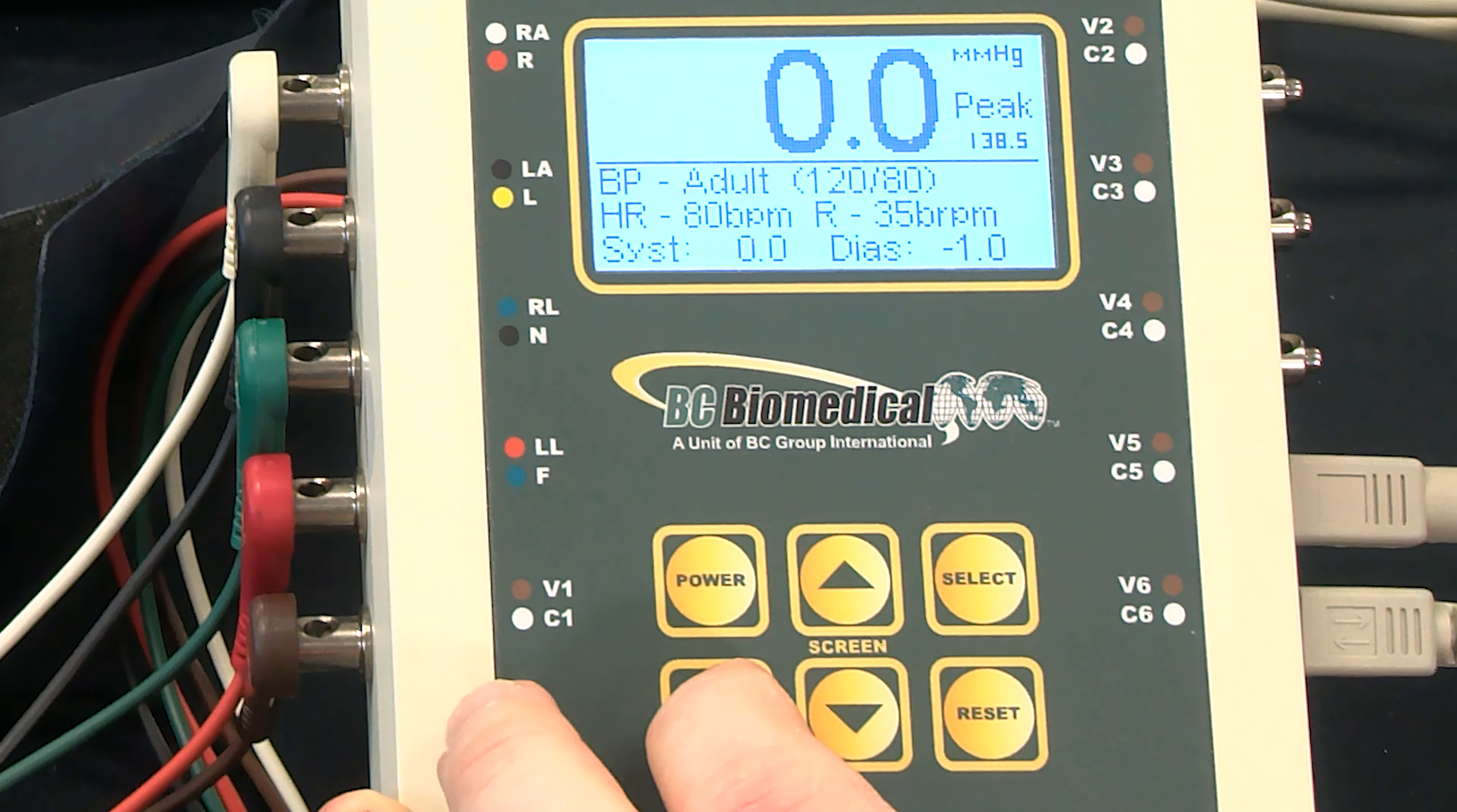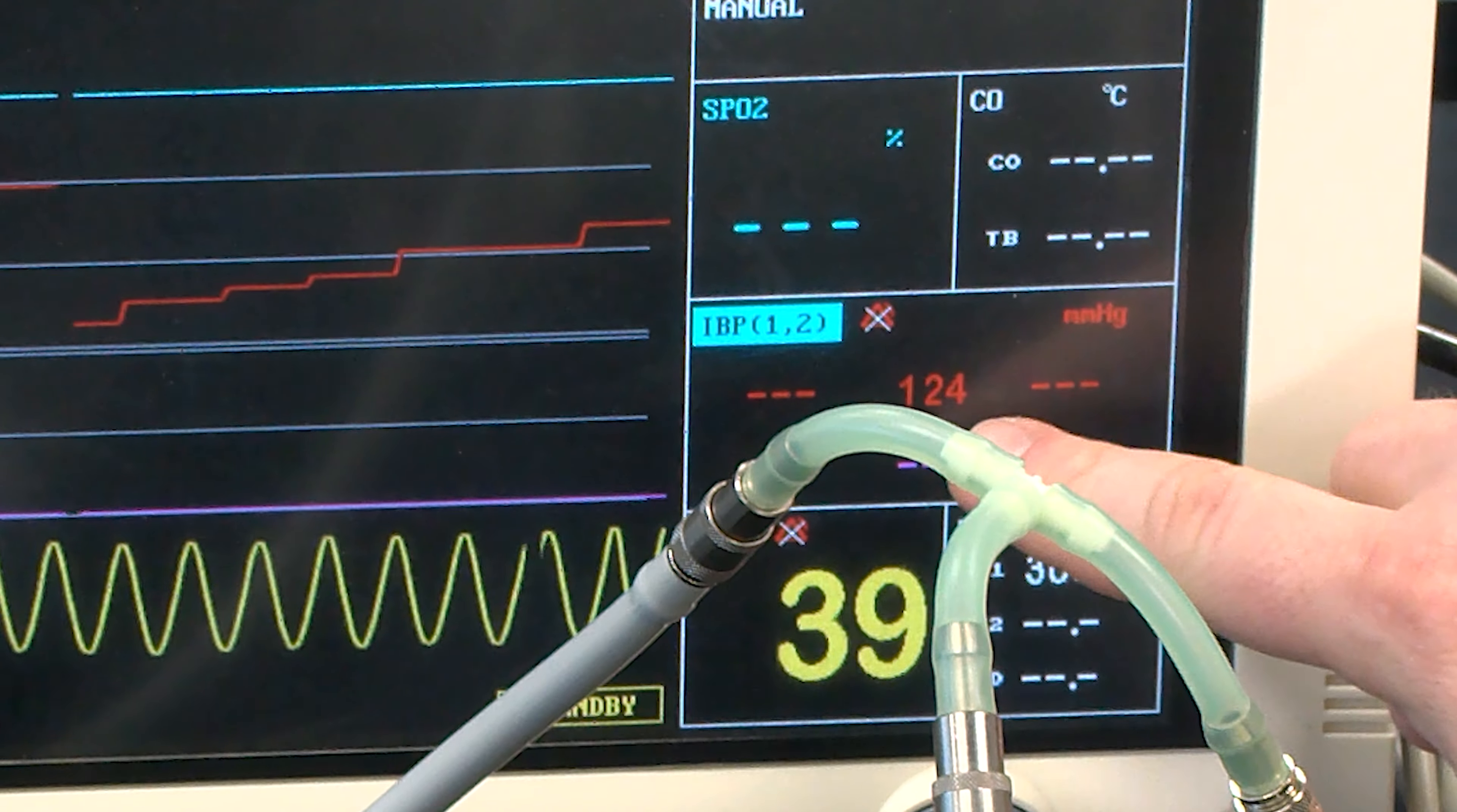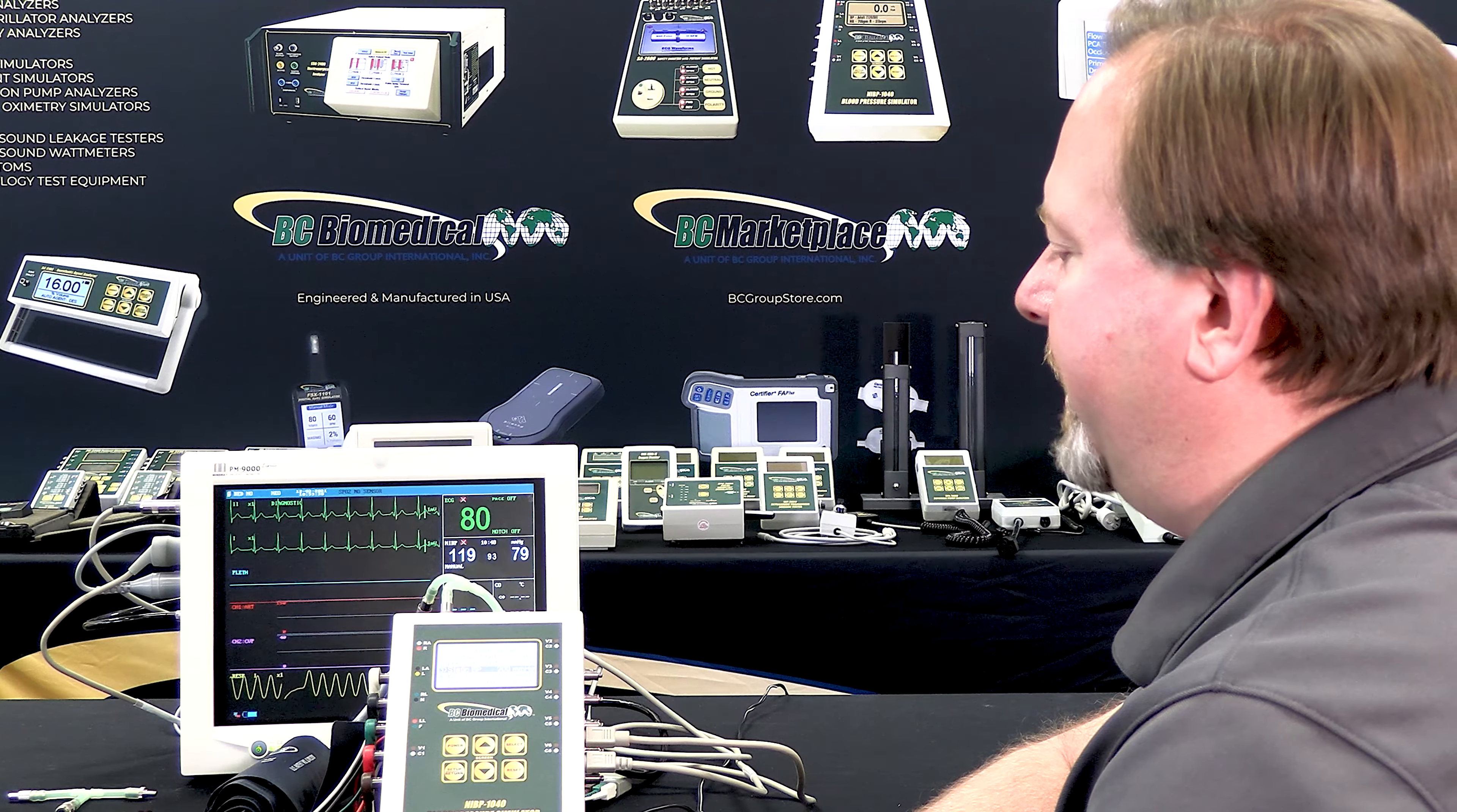To get to the static blood pressures, I would go to the setup menu, and I can scroll through the static blood pressure settings, and at that point I would watch for the center measurement to show me the static pressure that is being measured by the monitor, and so we can check that across the range to make sure that it is measuring accurately.